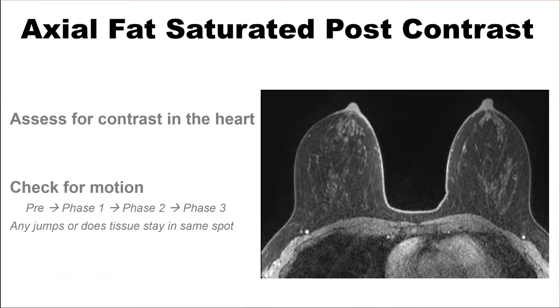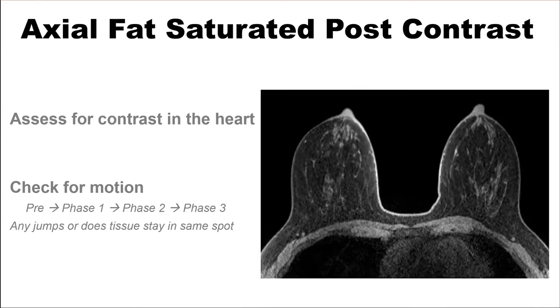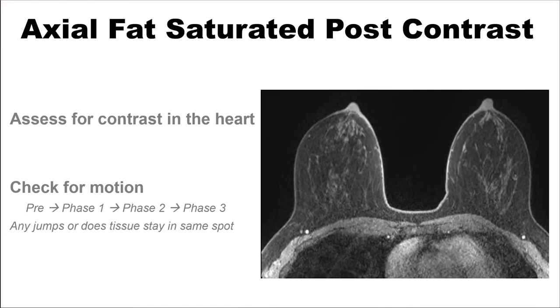Moving on to the post-contrast sequences. First, assess that contrast was actually administered and that the IV did not infiltrate. Next, check for motion artifact. Quickly clicking between the different phases allows you to see if the patient was moving during the exam. This will limit kinetic analysis and subtraction images.